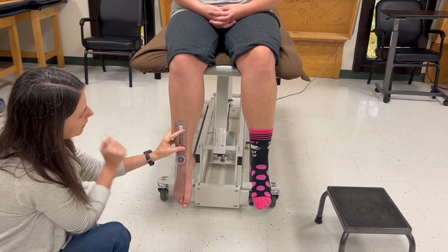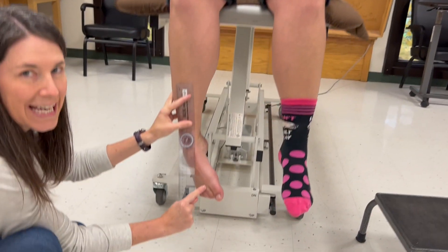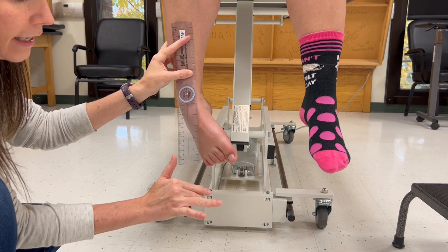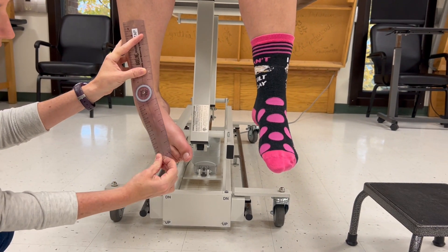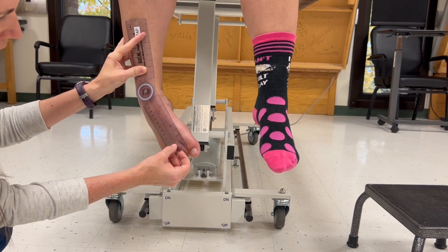I'm going to say to the patient: bring your toes in toward your other foot. The moving arm goes to the second MTP joint. In the hand it's the third knuckle — the third MCP — but in the toe it's the second MTP. I'm bringing the moving arm right to that MTP joint; it doesn't matter where the toe is going.